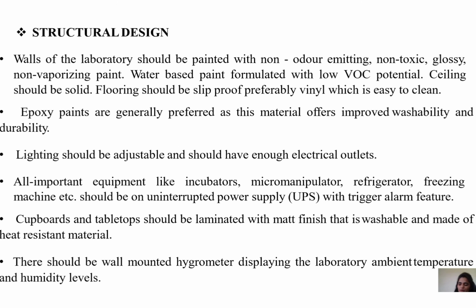All important equipments like incubators, micromanipulators, refrigerator, freezing machine, LAF, laminar air flow, should have an uninterrupted power supply with trigger alarm features. Cupboards and tabletops should be laminated with matte finish that is washable and made of heat resistant material. There should be wall mounted hygrometer displaying the ambient temperature and humidity levels of the lab.